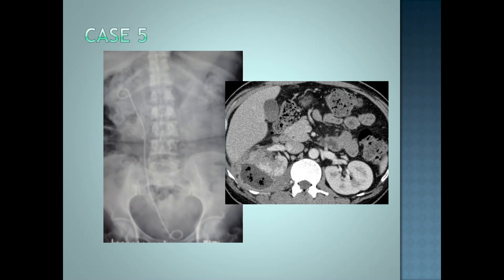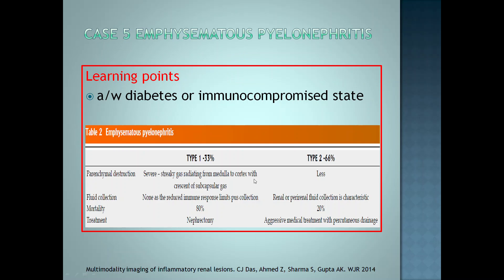The fifth case: abdominal radiograph shows presence of air in the right renal fossa. Contrast-enhanced CT shows heterogeneous enhancement with loss of corticomedullary differentiation in the right kidney. There is extensive perinephric fat stranding associated with perinephric collection with air within it. This is emphysematous pyelonephritis. This condition is associated with diabetes or immunocompromised status. Type 1 is more severe with extensive parenchymal destruction; fluid collection is limited, there is high mortality, and it can be treated only with nephrectomy. Type 2, shown here, is more common: parenchymal destruction is less, it is a less severe type, perinephric fluid collection with air is characteristic, mortality is less, and it can be treated with aggressive medical treatment and percutaneous drainage.